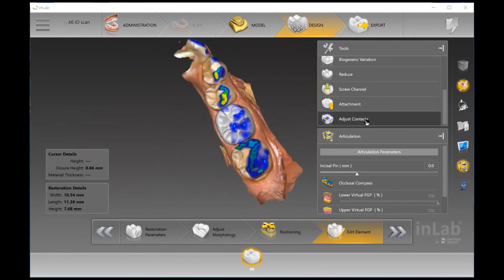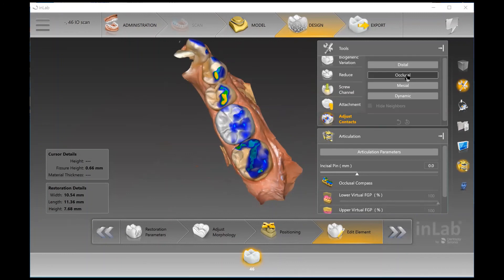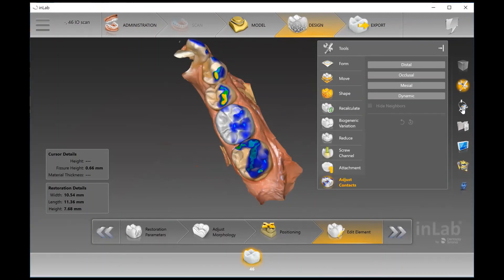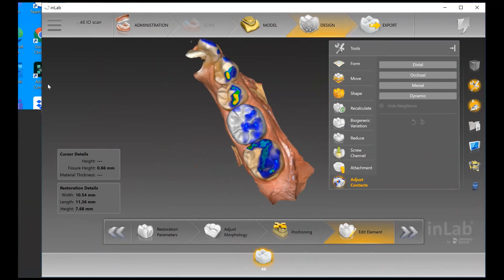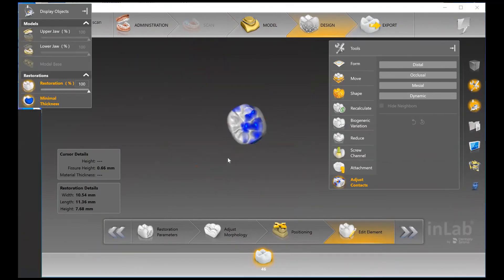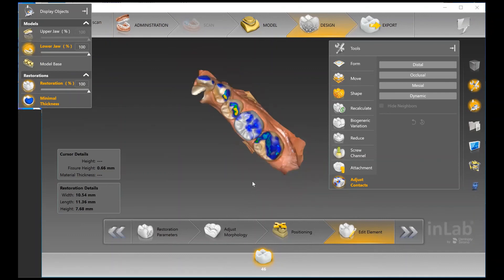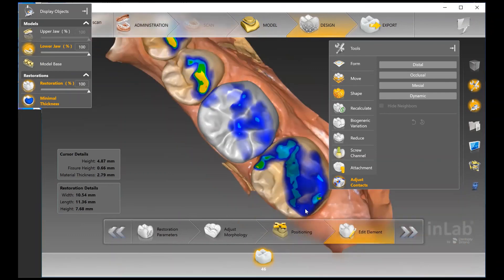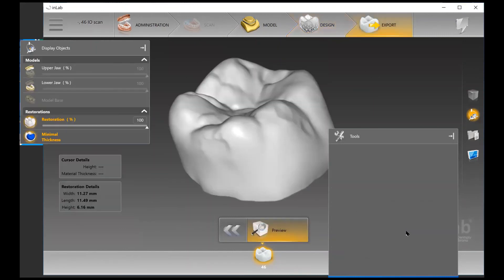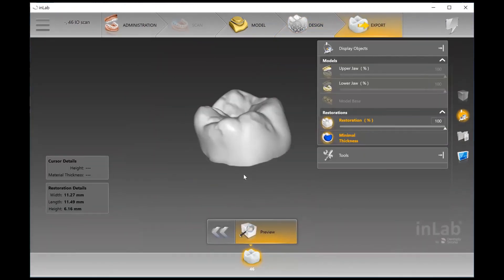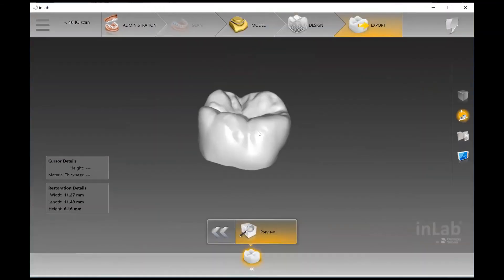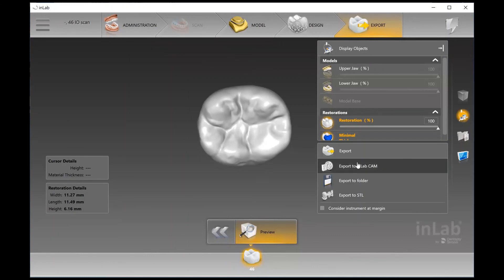Once you're basically happy, you can move forward to the Export phase. Here you can either export to InLab CAM if you are using a Dentsply Sirona milling system. However, if you're not using a Dentsply Sirona milling system, not a problem — the software is fully open and you can export as an STL file as well, so you can continue to use your own system.